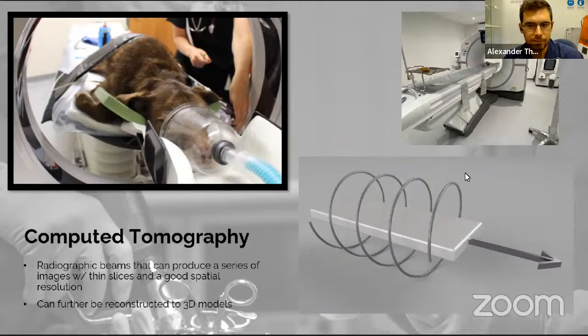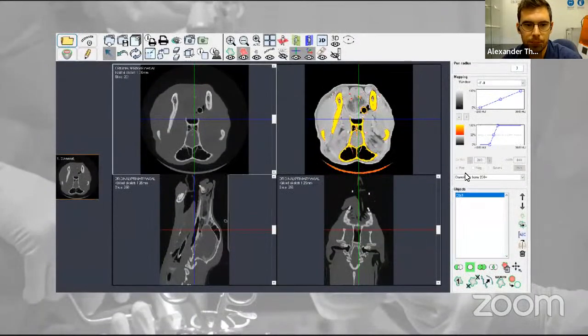It makes a huge difference if you have good or bad images. My tip is to improve the basic settings before going into the fancy modalities, to be sure about the basics and have good knowledge about them.